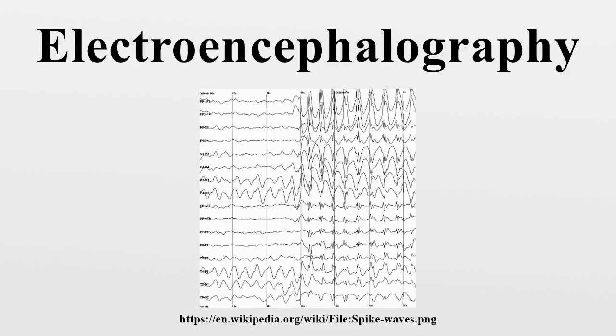Similarly, simultaneous recordings with MEG and EEG have also been conducted, which has several advantages over using either technique alone. EEG requires accurate information about certain aspects of the skull that can only be estimated, such as skull radius and conductivities of various skull locations. MEG does not have this issue, and a simultaneous analysis allows this to be corrected for.